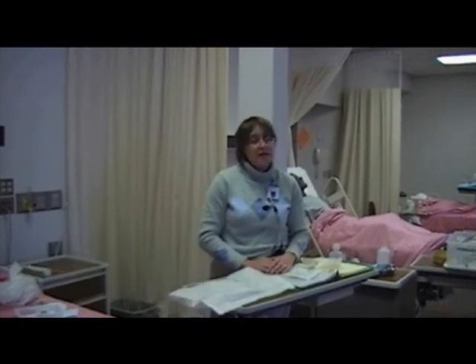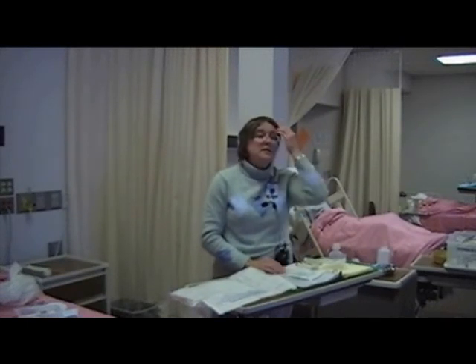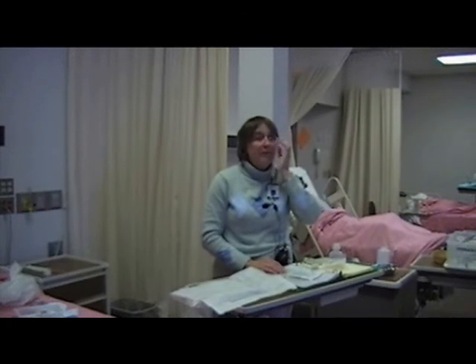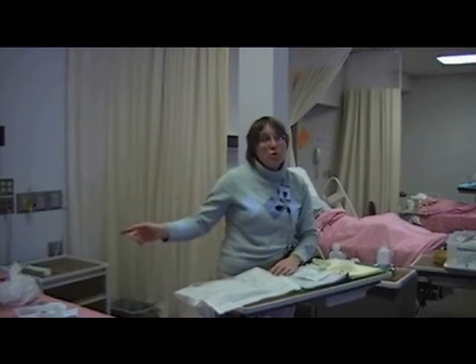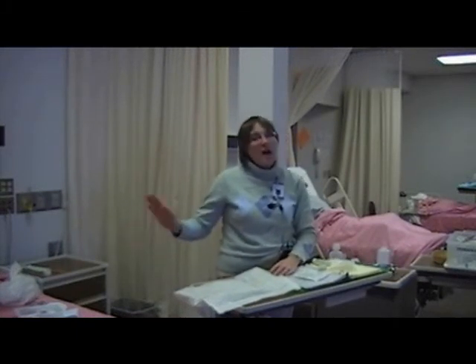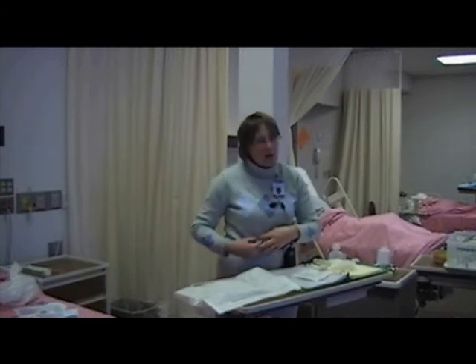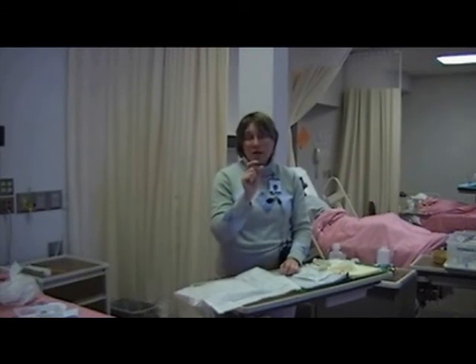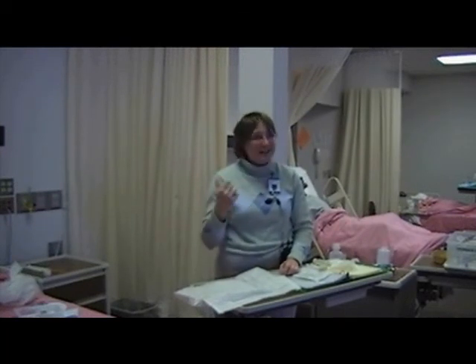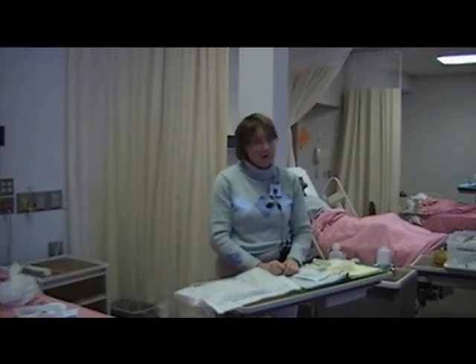Are there any questions? Okay. Yes? When you're doing that 30-second scrub, it looked like, was there a chance that the PICC line would run off? It was moving on him, wasn't it? Yes. Part of it is because the way that I set it up on the mannequin, I had it way low. Sutures normally are very close to where it's actually inserted, so I've not run into that being an issue because usually those sutures are very close, so that I didn't actually dislodge it when I removed the outside. I put it way lower than what you will ever find.